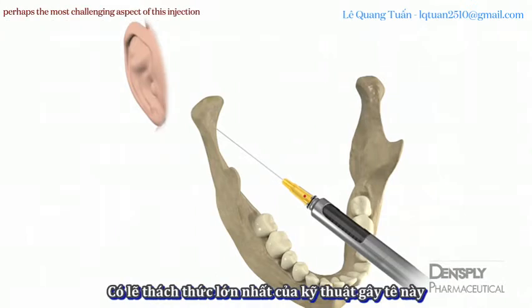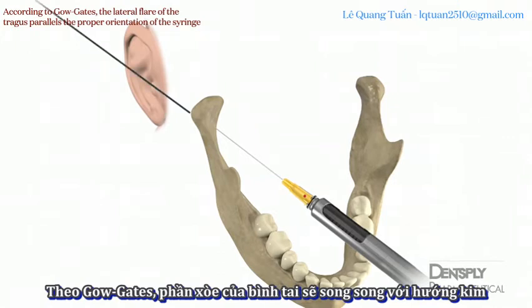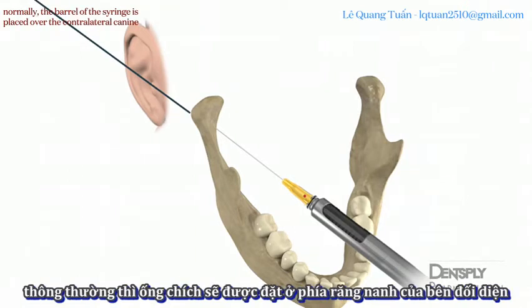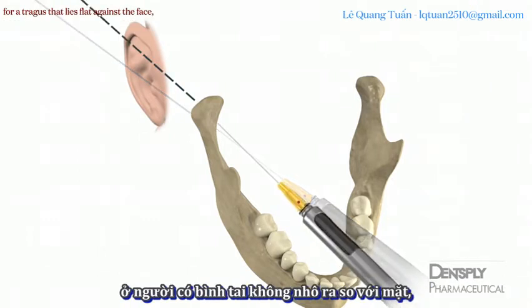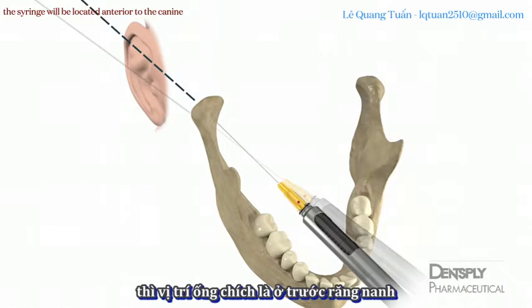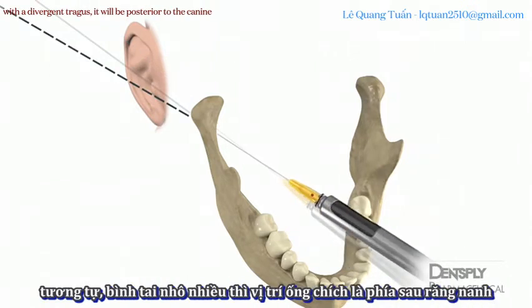Perhaps the most challenging aspect of this injection is determining the proper angulation of the syringe within the plane of insertion. According to Gowgates, the lateral flare of the tragus parallels the proper orientation of the syringe. Normally, the barrel of the syringe is placed over the contralateral canine. For a tragus that lies flat against the face, the syringe will be located anterior to the canine. With a divergent tragus, it will be posterior to the canine.